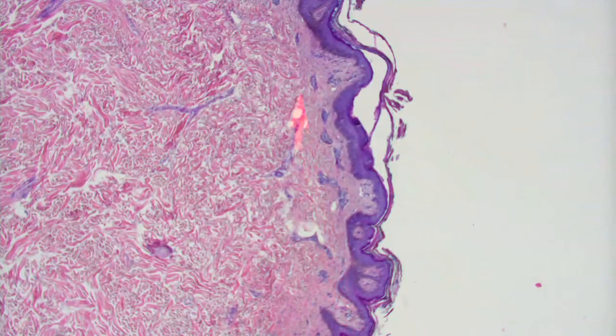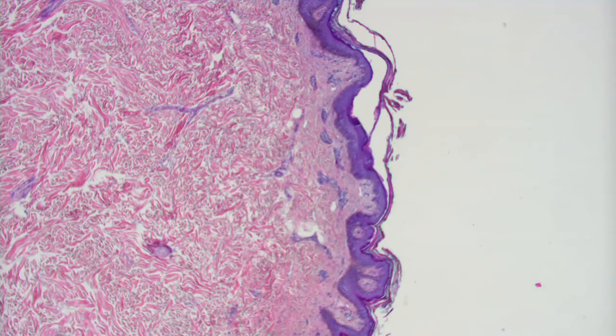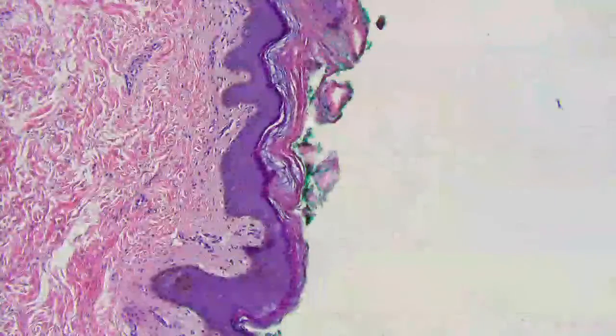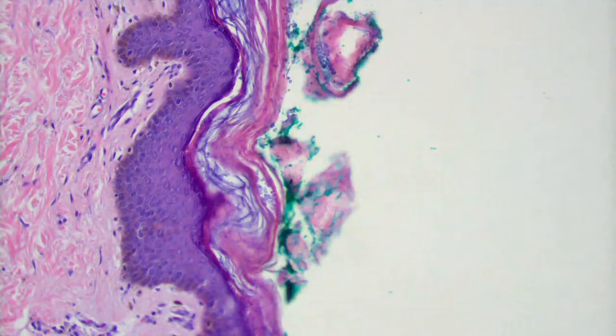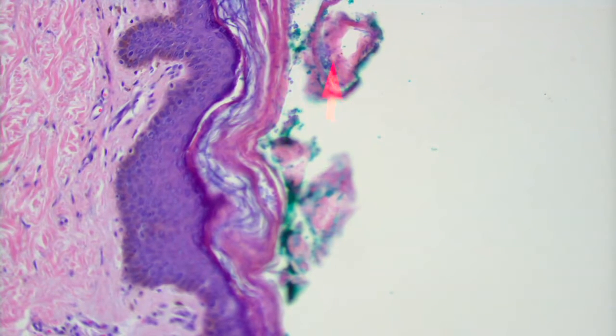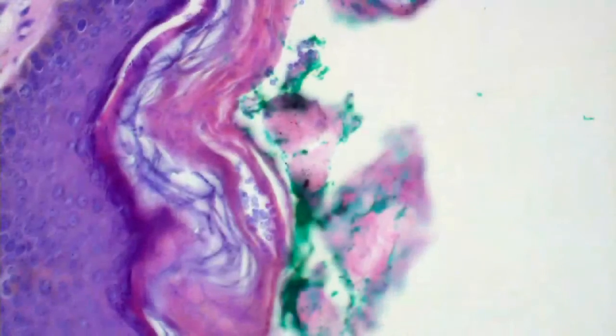And then the main changes are up here, in the epidermis, in the cornified layer. So when you look in detail in the cornified layer, there are some non-human organisms, okay. So what was up here? So these are tiny round organisms that I think are probably tinea versicolor. Yeah, you've got the round spores here, and you've got hyphae. And so that's what some people refer to as the so-called spaghetti and meatballs appearance.